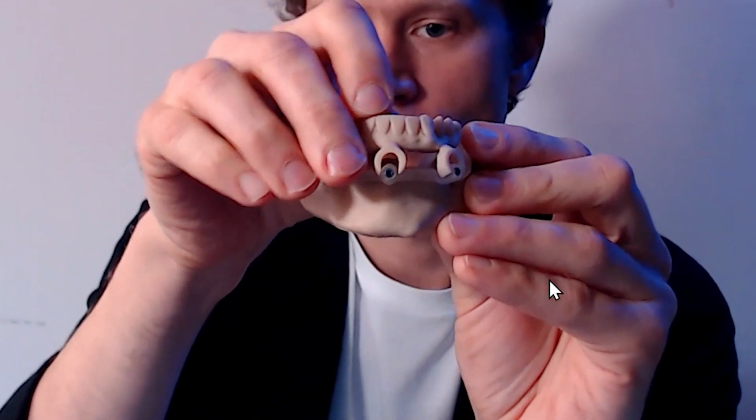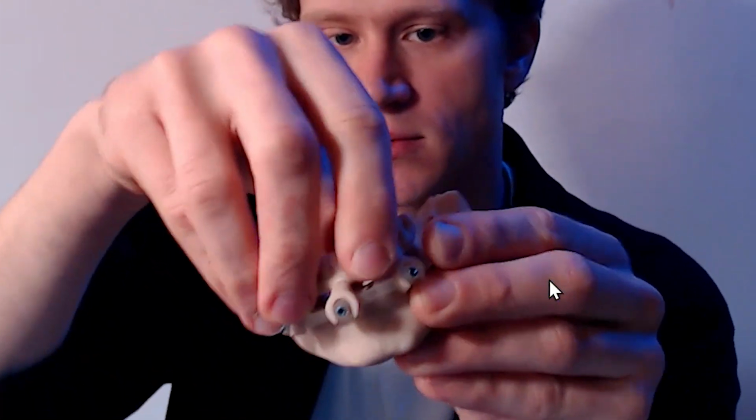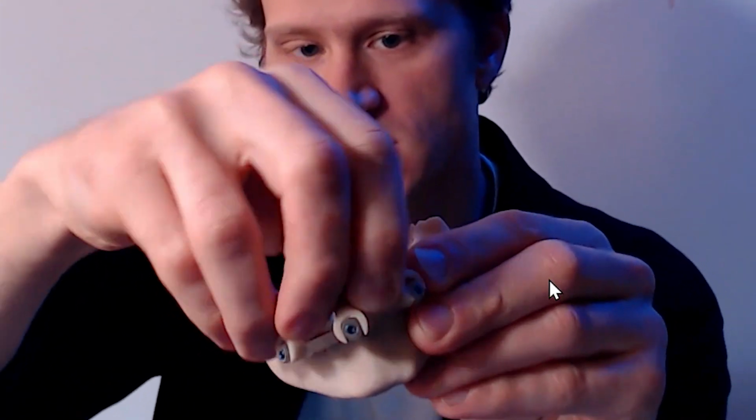Then a printed prosthetic design is taken and also fixed to the reduction guide. The abutments are fixed to the construct. Then they are unscrewed. The construct is removed and finalized in the lab. After that we can remove the bone reduction guide, suture the wound, and fix our temporary prosthetic structure in the mouth. Let's break down how to make such a case.